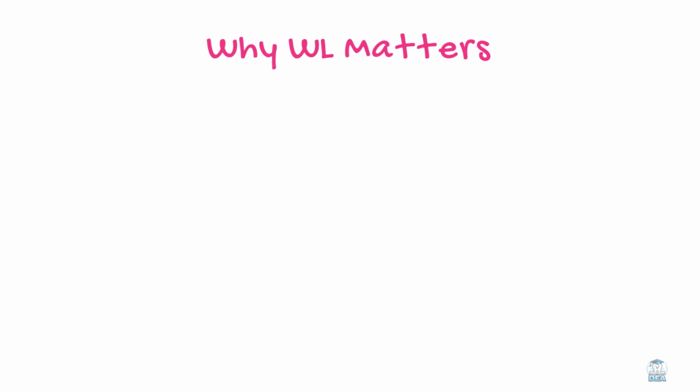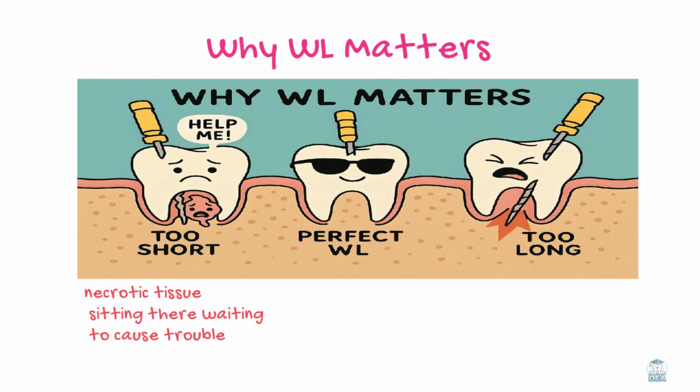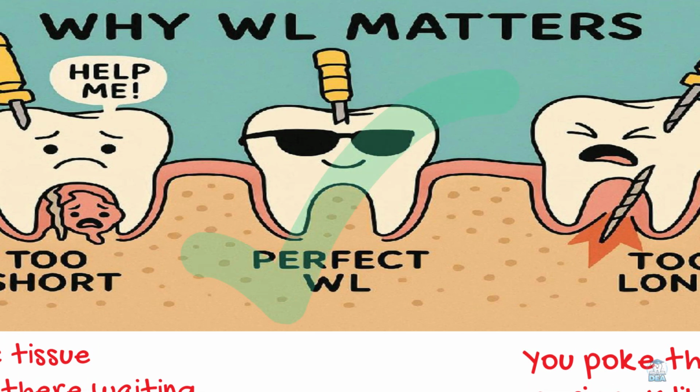Why does this matter? If you stop too short, you leave zombies behind, necrotic tissue sitting there waiting to cause trouble. Too long, you poke the periapex like a needle, irritate tissues, and your patient will definitely remember you. But the correct working length? That's where perfect cleaning and beautiful obturation happen.